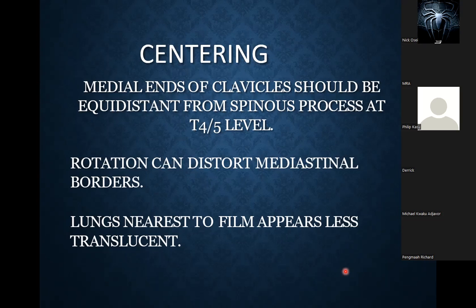Before we go through the schematic way of reading X-rays, when you take an X-ray, you should be able to run through that algorithm to effectively interpret the chest X-ray, all right? One of the things you look out for is centering. And centering simply means that the ends of the clavicles are equidistant from the spinous processes at T5 or T4.